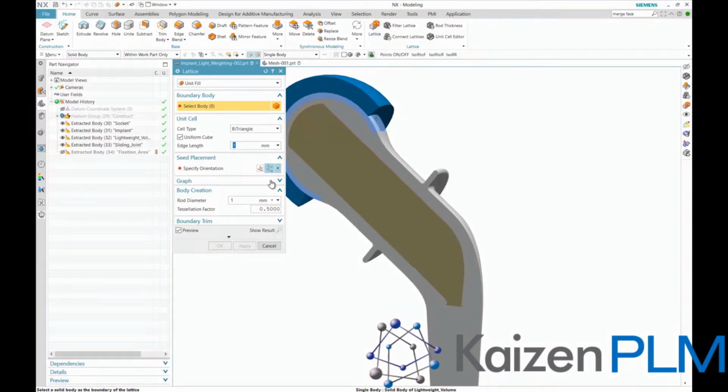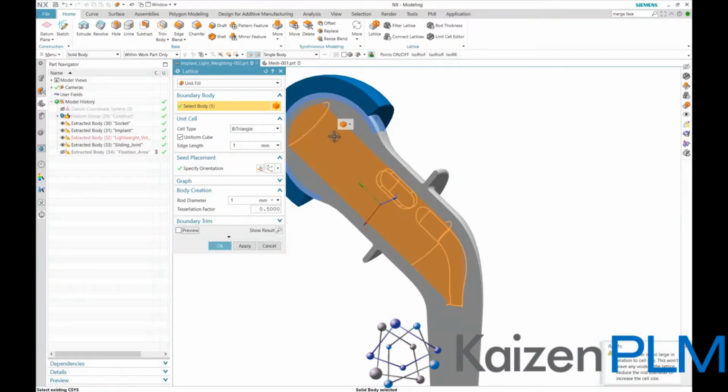We start the lattice application. A tip here is to turn off the preview, as this can cause some waiting depending on the complexity of your lattice, shape of the fill volume or surface, and what settings you are using. As we want to fill a volume with a specific lattice, we set the lattice type to unit fill and select the already prepared cavity volume.